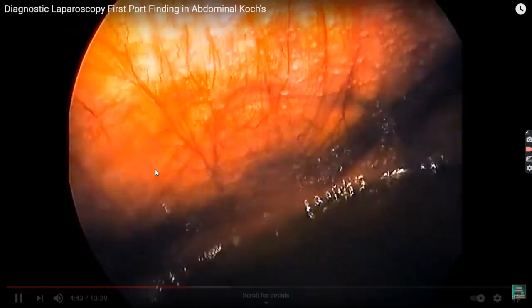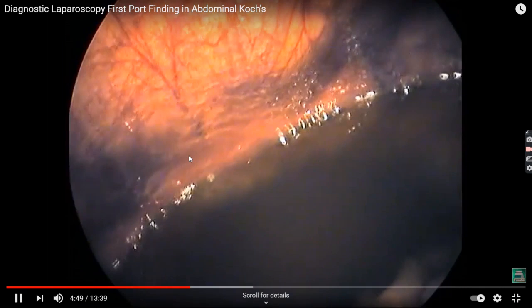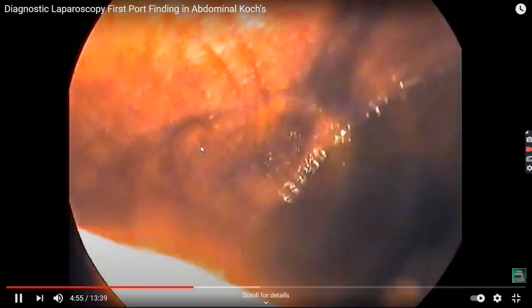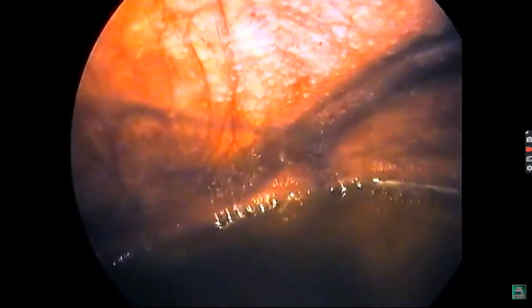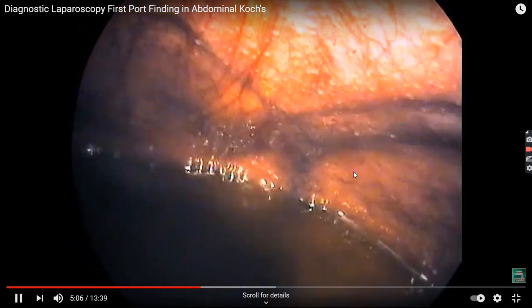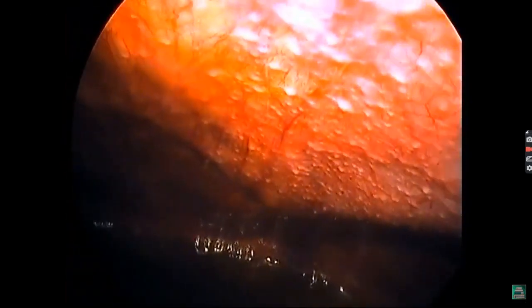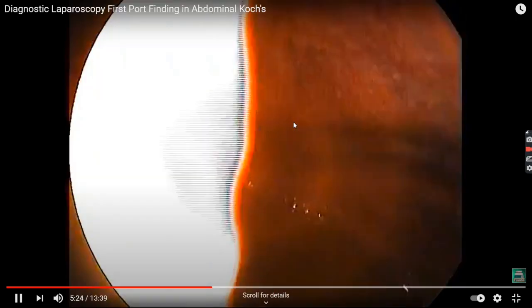So here you can see I'm just pressing the anterior abdominal wall from outside, and the impression you can see inside with the help of the telescope, right, in the probably infraumbilical area. Yes, through the infraumbilical area I'm going to put another port. You can see the impression of inferior epigastric vessels here. So always try to prevent injury to these vessels. Here also tubercles are present, right?